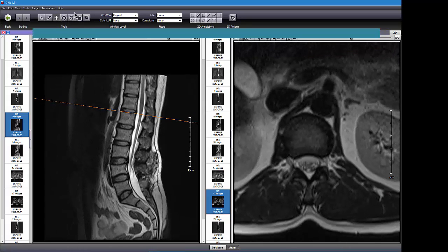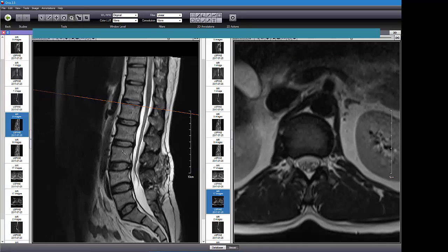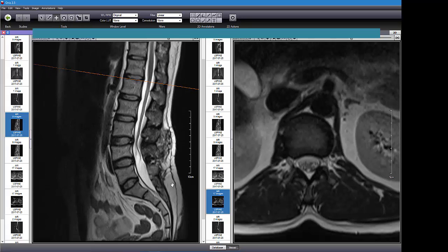So let's pull this open. I have no idea how much time we've spent. I want to try not to make this too big. So again, to get your bearings, here's the stomach. Here's your butt down here. Here's your back. Here's where the fusion came through. You can see all the scar tissue here. Here's L5, L4, L3, L2. Discs still look pretty good. Sacrum here.